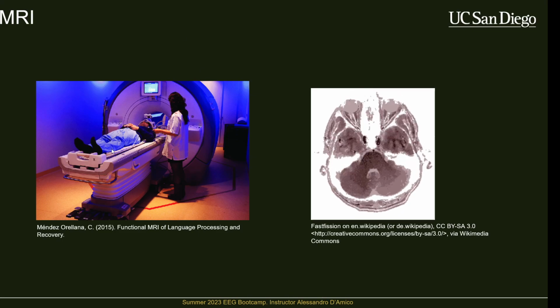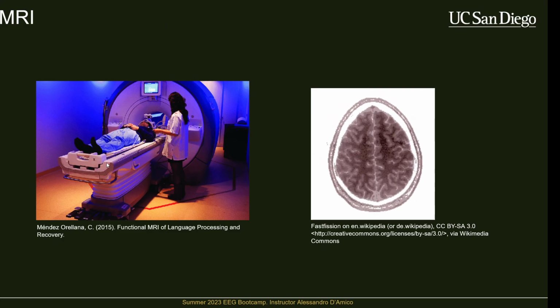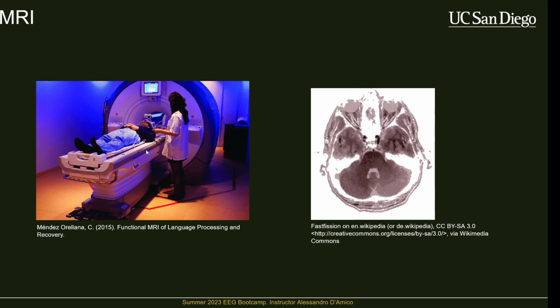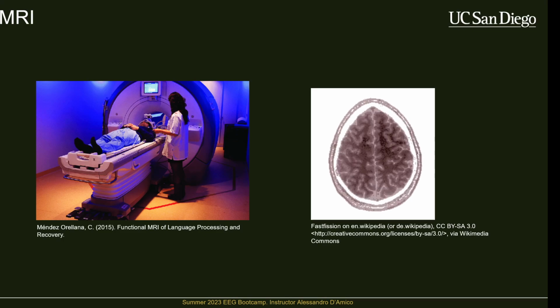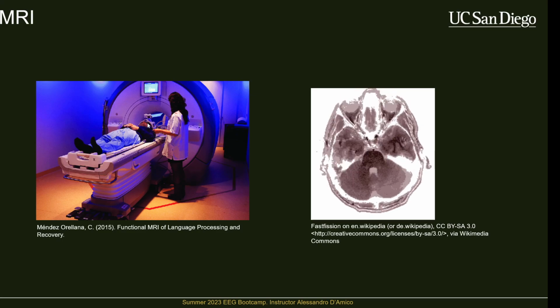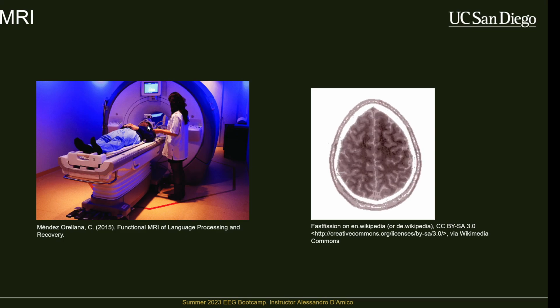You're put into a rather claustrophobic chamber. For those of us who have done it, you know that once you get inside of this machine, it is blaringly loud with magnets that are just constantly thudding. It's really intense. You have to stay very, very still because if you move your head at all, it's not really going to be imaging the same location.